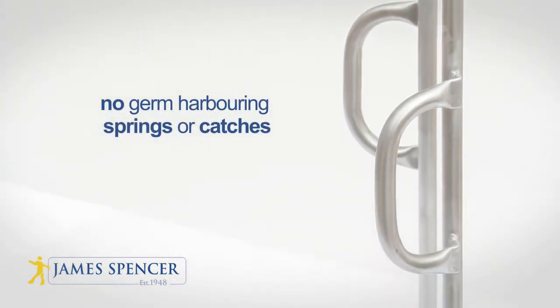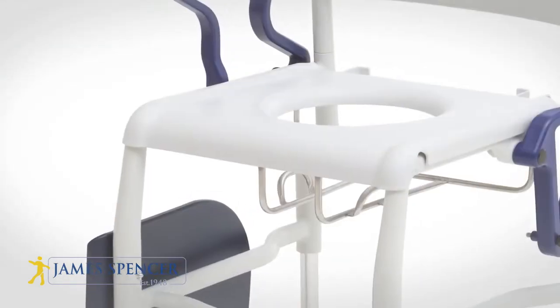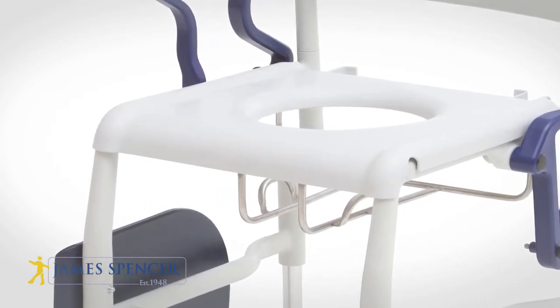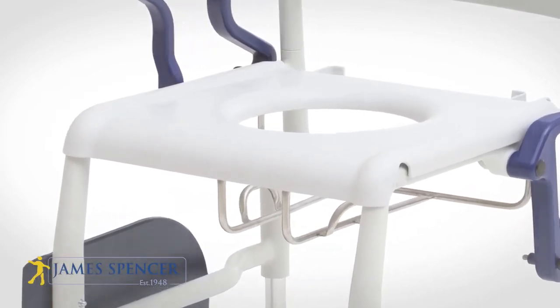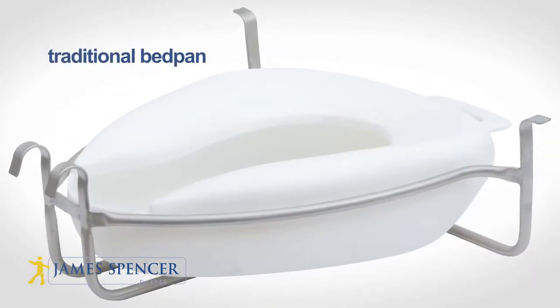There are several main bedpans used in the UK, some being cleaned in autoclaves, some being disposed of in macerators. All have a rack option designed to hold them in the correct position underneath the aperture. Here are the most frequently used.